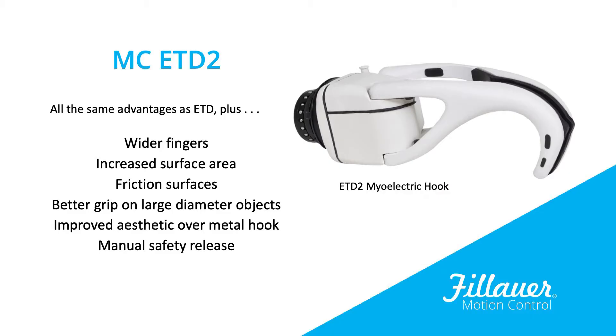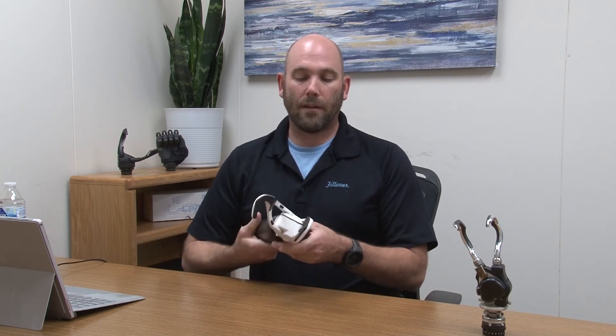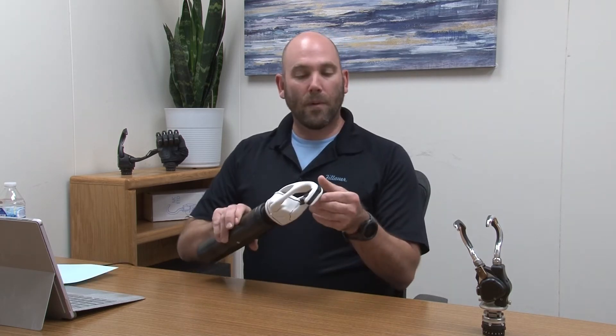Next, we're going to talk about our ETD2. This is our second generation Electric Terminal Device here at Fillauer Motion Control. It has all the same benefits as the original ETD, but as you'll notice, it has a more aesthetic design. Wider fingers are going to provide more surface area. Also, if you look at this device, you'll see some grip pads on the outside of the hook. With these friction surfaces, we get a lot of passive functionality — great for moving objects around on a desk like a piece of paper. In field trials, users really liked that benefit.